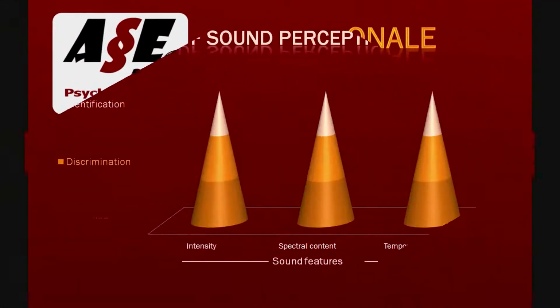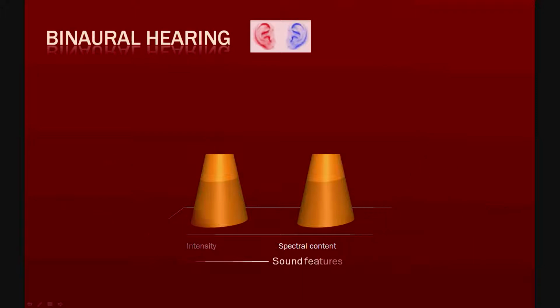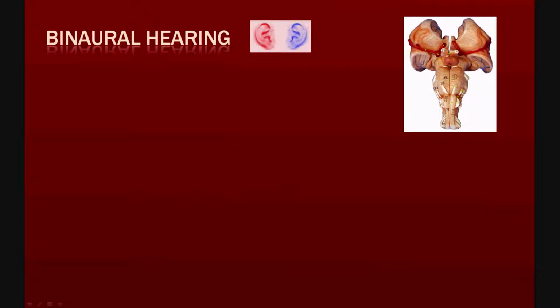The ACE localization test is different from all other ACE tests. It does not assess monaural sound perception. It rather aims at assessing the central integration of binaural sound input. The processing of sound coming from both ears is done at the level of the brainstem and higher central pathways. One typical capacity that requires good central processing is the capacity of localizing the sound source.